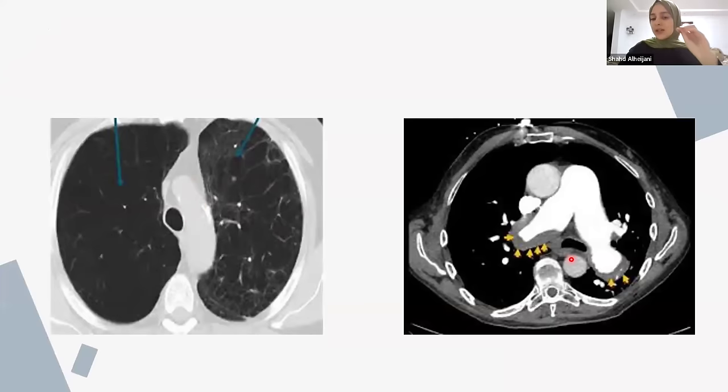Here, abnormalities would be clearest in the mediastinum. But the lungs are not very clear. You can't really tell. The soft tissues, for example, you can't tell that much. But here, the mediastinum is the clearest. So this is the mediastinal window. You focus the range of attenuation at that appropriate for the mediastinum.